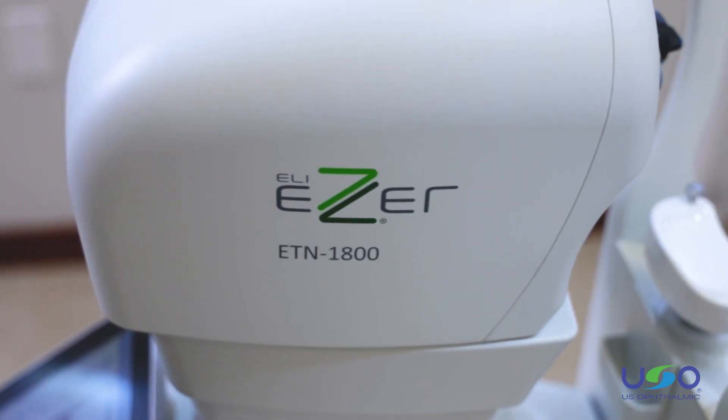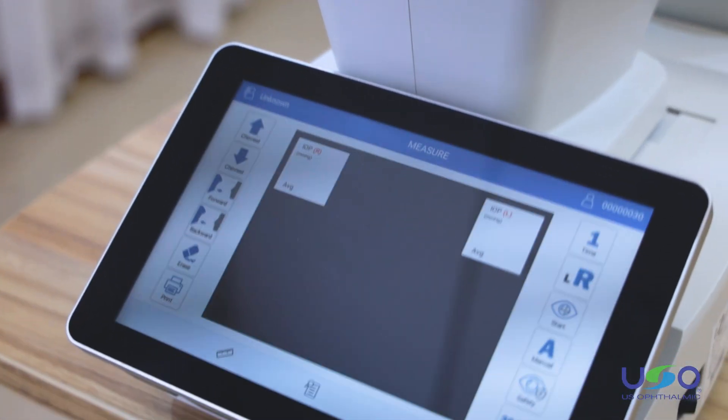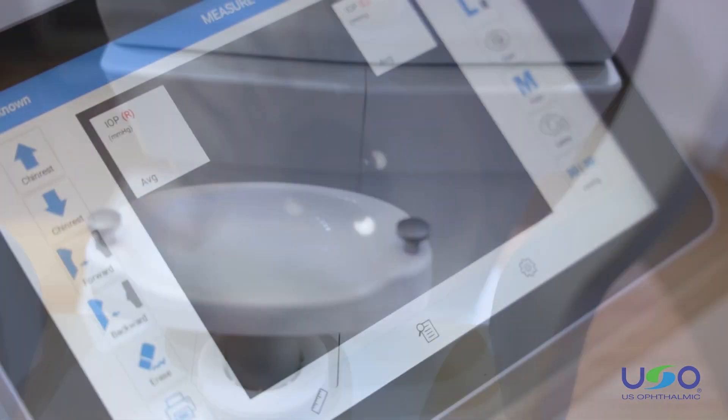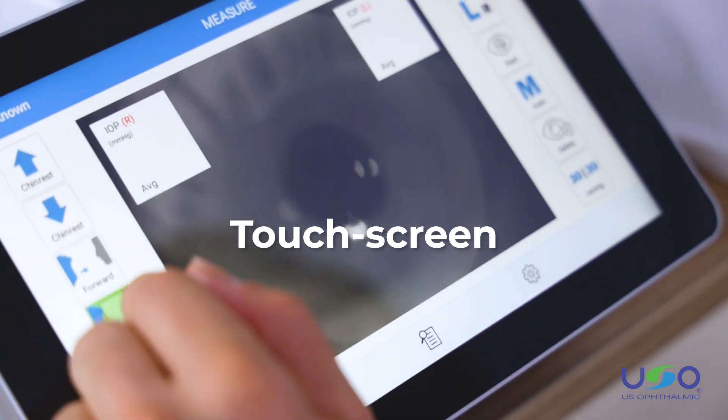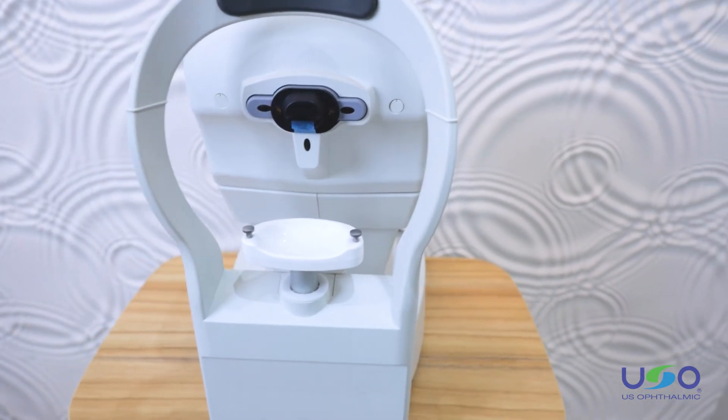The ETN 1800 is fully automatic, making it easy for anyone to use with minimal training. It encompasses an intuitive and friendly interface, and the tonometer is controlled from a touch screen. No joysticks or knobs — complete control is at your fingertips.